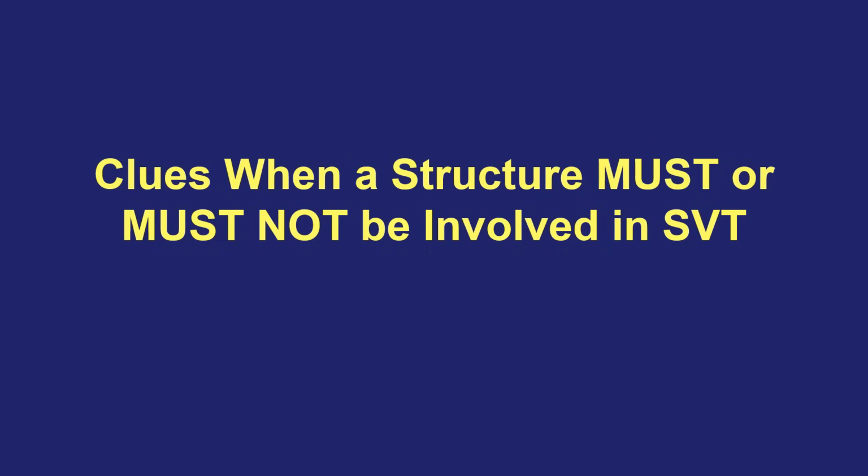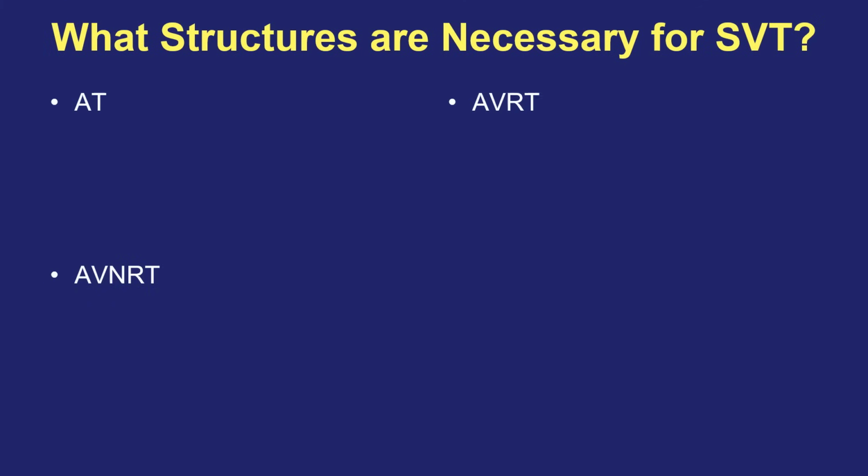And these findings have to do with the anatomy of the tachycardia itself, and I'll show you what I mean. When you think about the anatomic structures that are necessary for each SVT mechanism to perpetuate, there are clear differences between the 3. And here's what I mean.